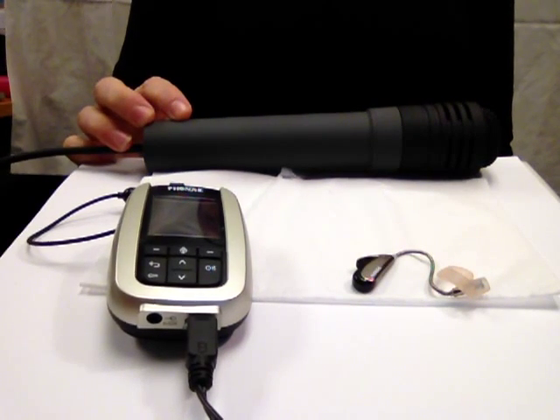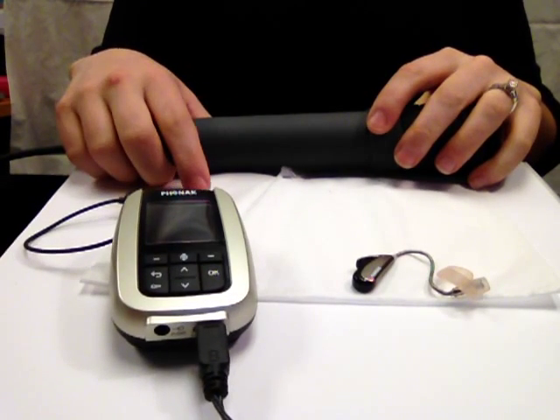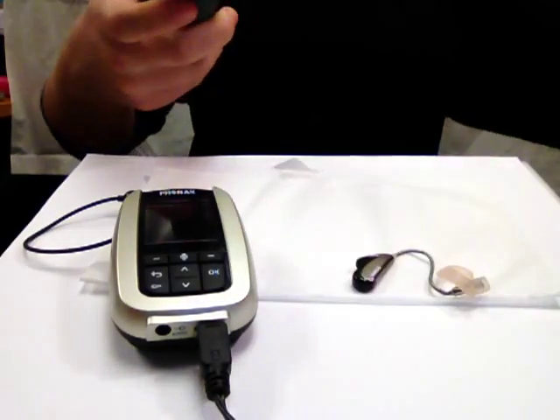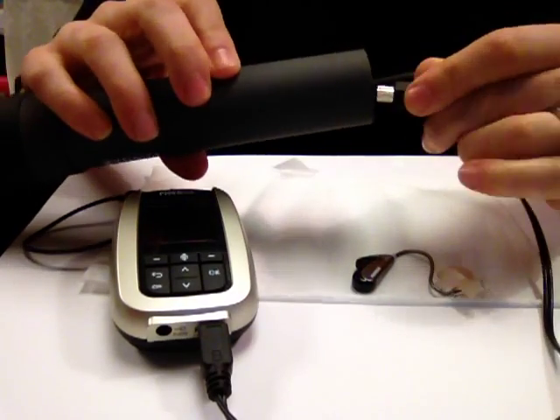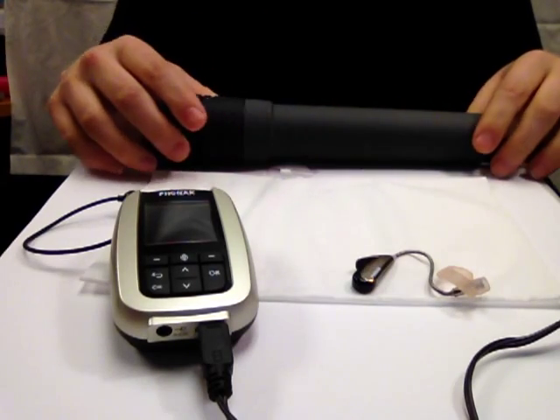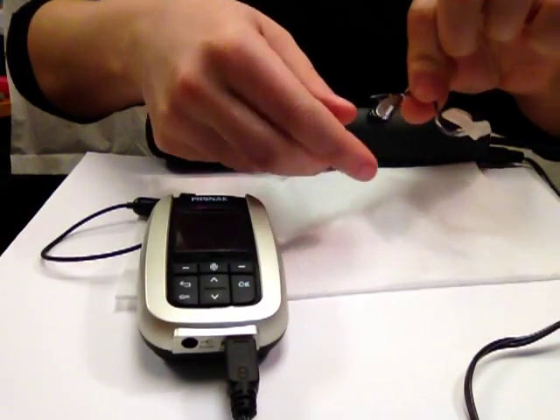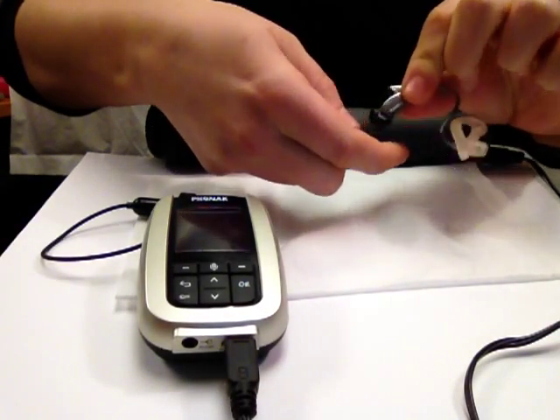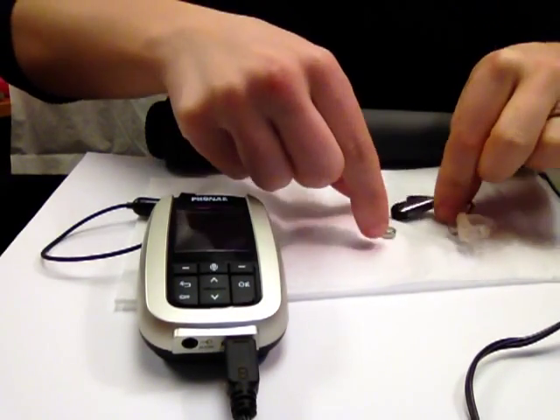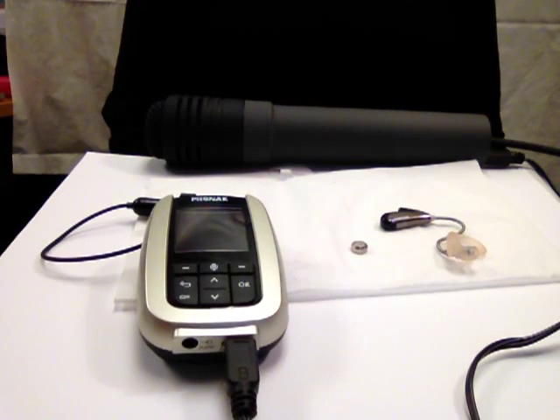If you're using a DynaMic transmitter, it should also be turned off, and the charging cord should be plugged in to the transmitter and of course the other end into a wall socket as well. Open the battery door on the iSense receiver and take the battery out. Leaving the battery in and the door shut will drain the battery. Put the iSense and the battery into the case provided. Close the case to protect the equipment.